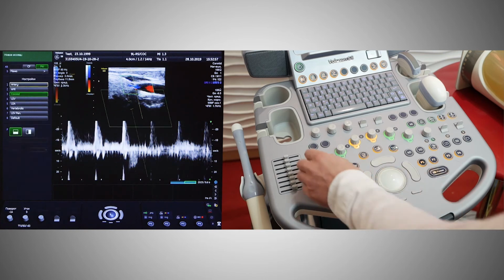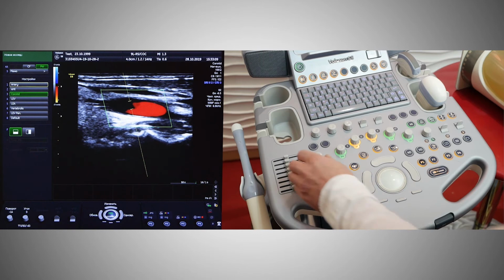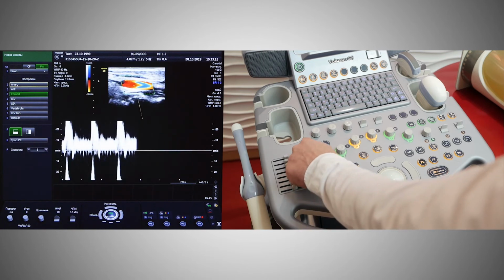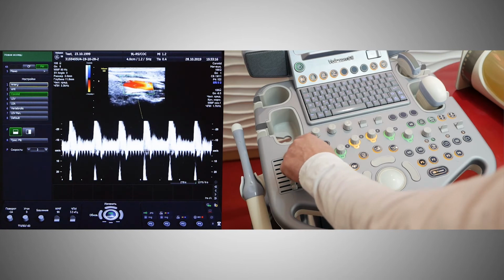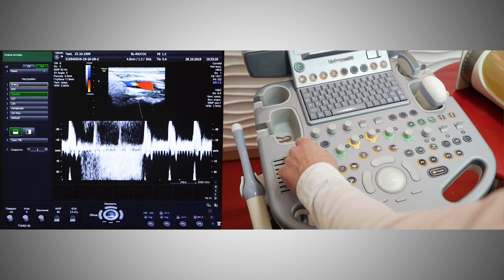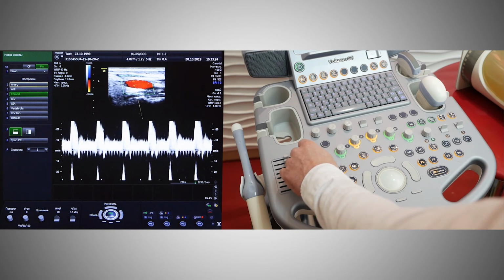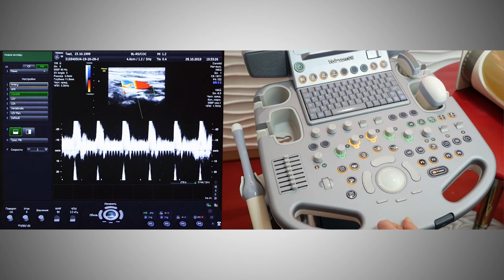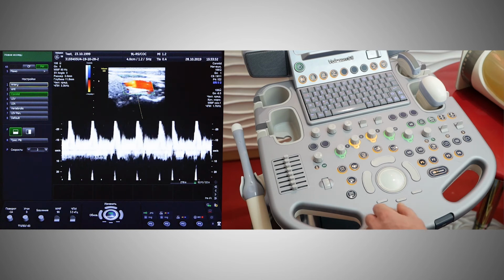Sound button. And again, the function buttons that we use in this case for pulse wave Doppler are marked.